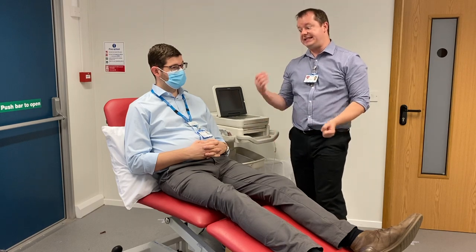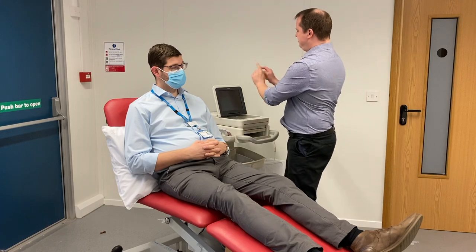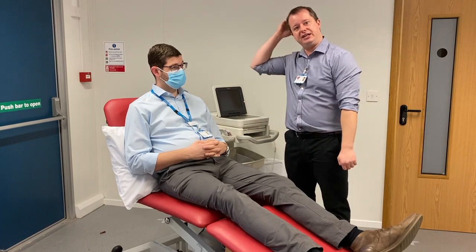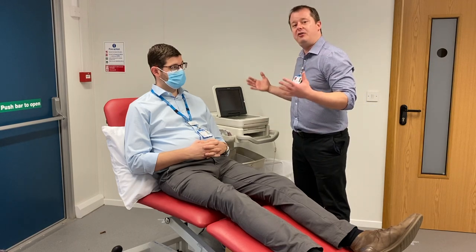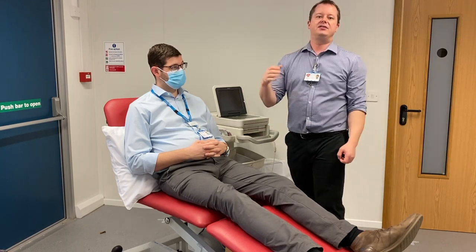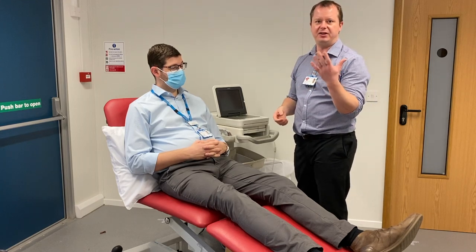I also want to make sure that I identify the patient correctly, because when we do this test we're going to input the patient's details into our ECG machine. When we press print and get our ECG, it will be uploaded to eCare, so instantly, wherever you are, you'll be able to look at the 12-lead ECG.